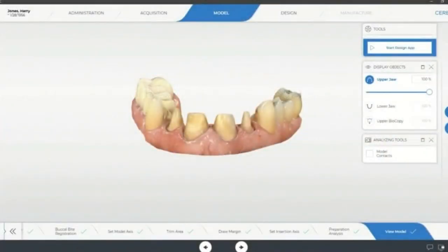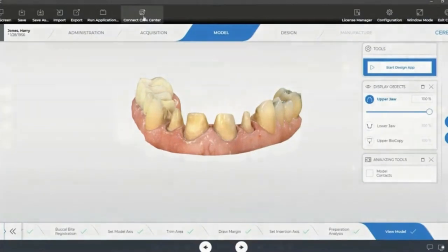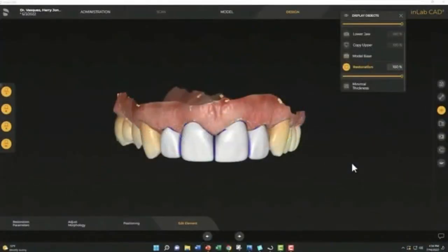Again, patients come in for restorations. We take our digital impression, and then from there, we move into the InLab software. In this case, this patient came in because he wanted a crown on tooth number 8. And I said to him, why don't we do just the four front teeth so we can give you a beautiful smile, and we'll print these restorations so you can see how you're going to look. And he agreed with that. So that's what we did.